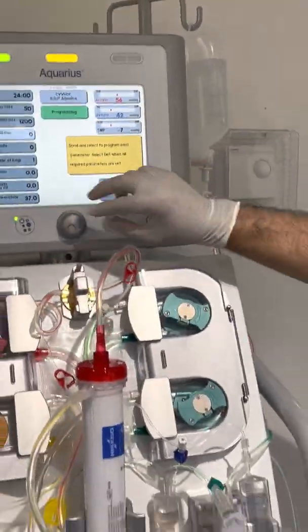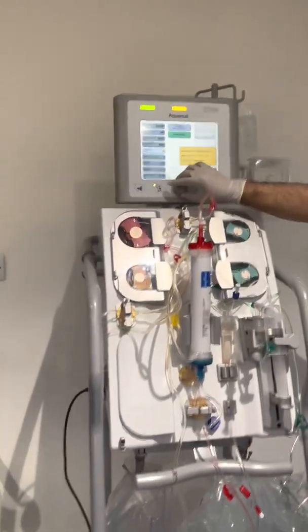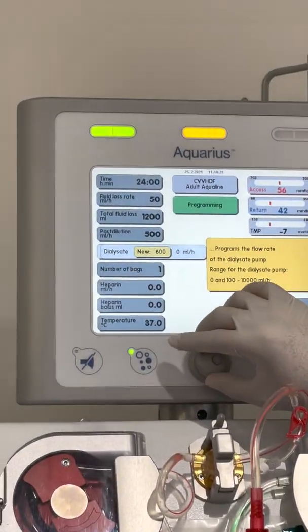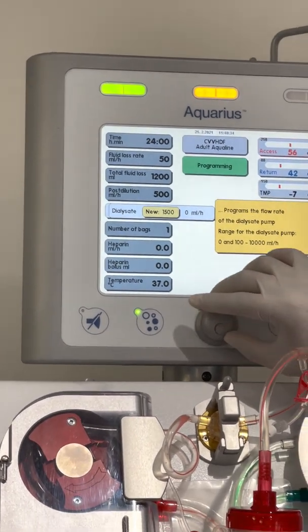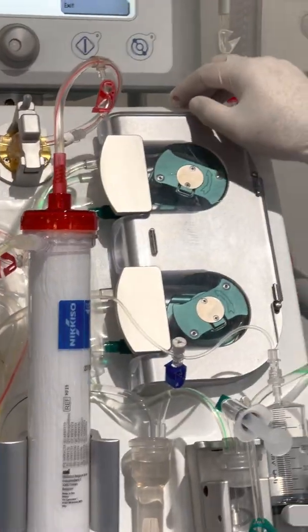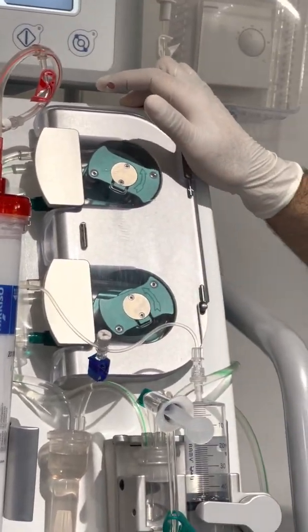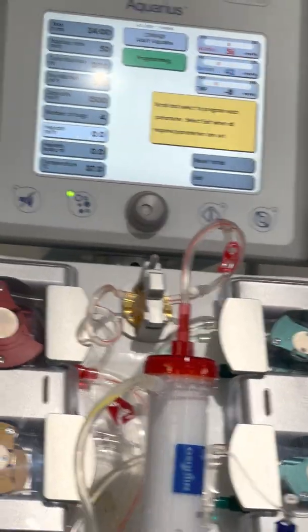Okay, so here the post dilution is around there. Then the number of bags, of course, we're using 4 bags, so it's 4. But if you started already with 4 here, you cannot put 3 there because it will affect the balance. Just make sure that it's 4 always.